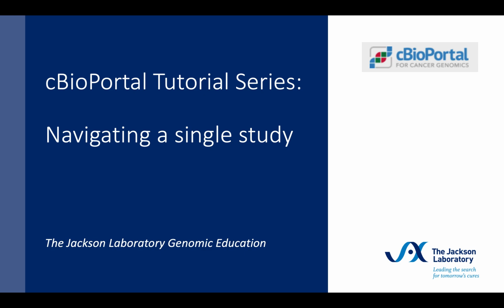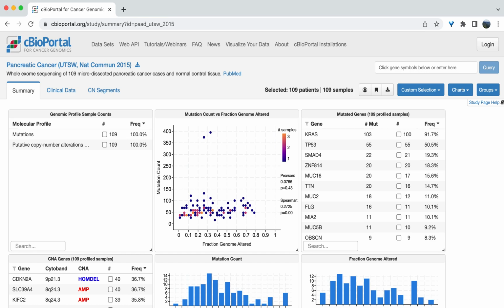This video will describe how to navigate through a single study page on the cBioPortal. Once you have selected a study to explore on the cBioPortal, you will enter the main study page as shown here in this pancreatic cancer study. The name of the study is at the top of the page, along with a few tabs.